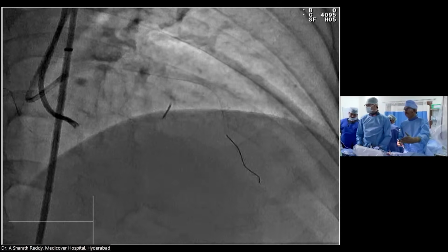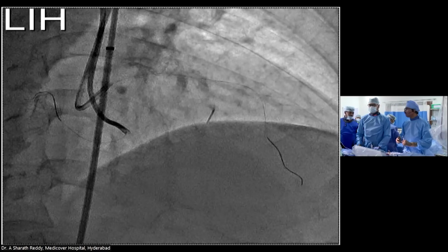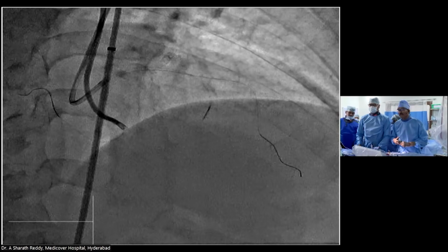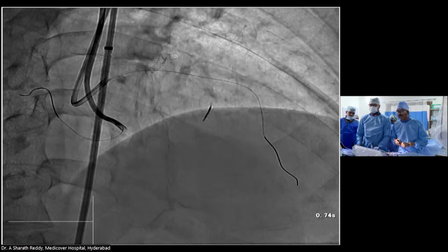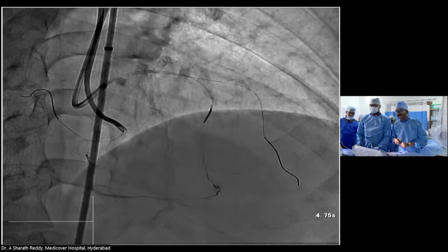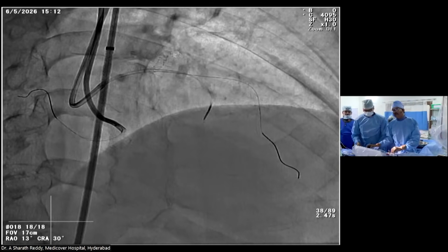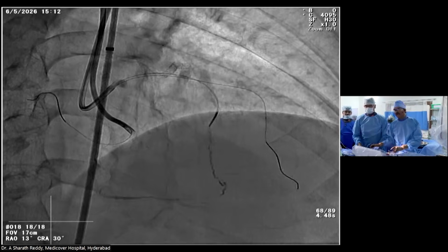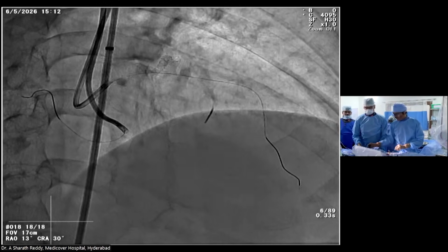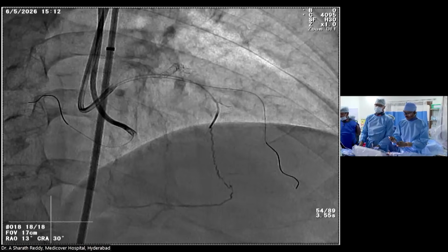I agree too, because preparing the antegrade is very important, even in a retrograde approach. So I would initially try an antegrade, but I was guided. I would like to evaluate the proximal cap with an IVUS. It may not be successful, but at least I want to see the proximal cap with an intravascular image. So you are already here in the retrograde mode. Shall I show what I have done?